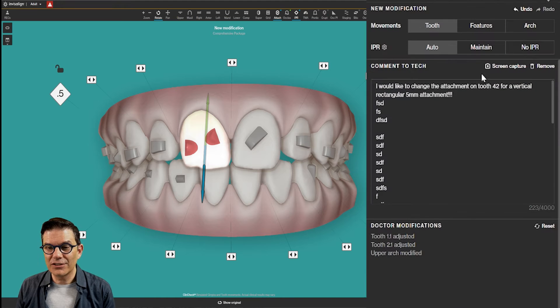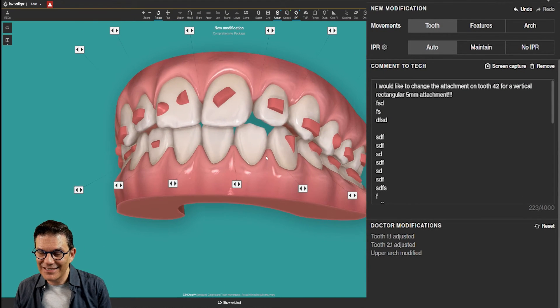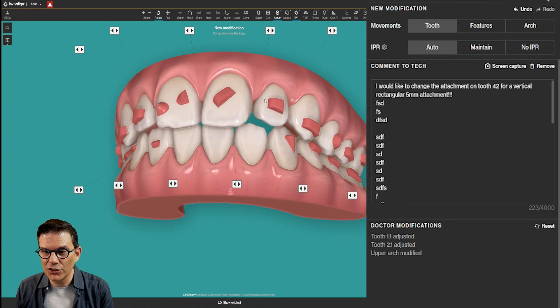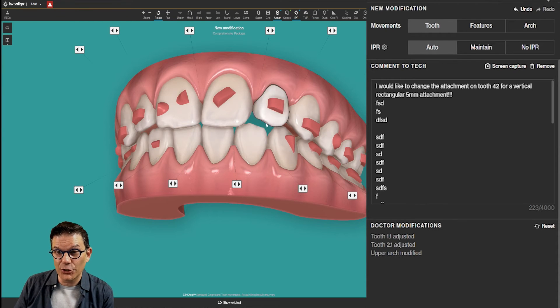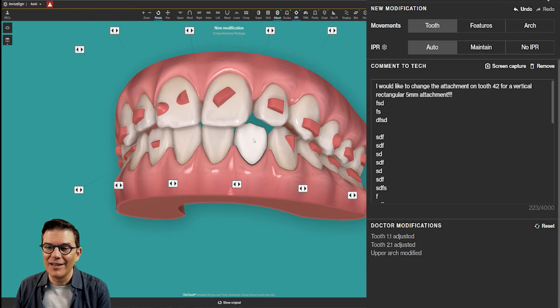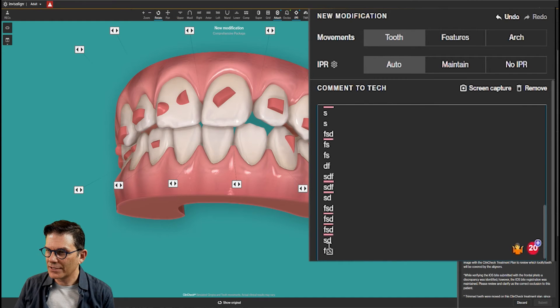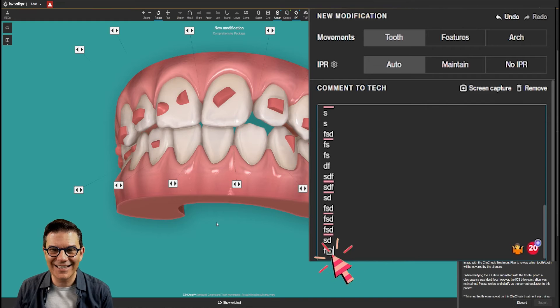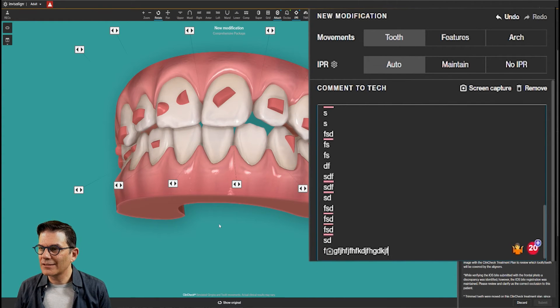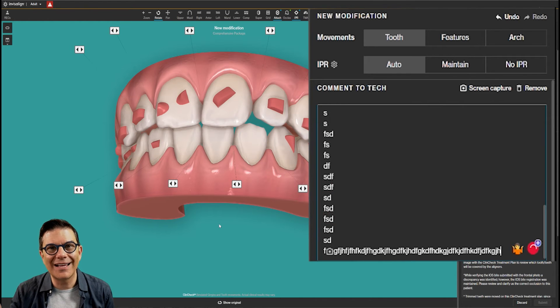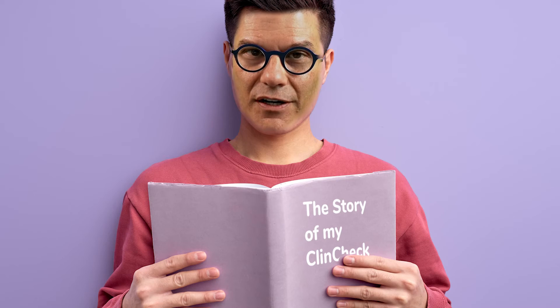You can also take screen captures. Let's say I would see something in this view and I really want the technician to see it — because I want to explain that I don't like the space we see between the upper lateral and the lower left, for example. I could take a screen capture there. And if you see here in 'Comments to Tech,' there's this little camera icon. If the tech clicks on it, they will see the exact same view, and next to it you can write your explanation. Try to write in a language they will understand. Don't write a novel. Be brief, be precise, go straight to the point and explain what you want.